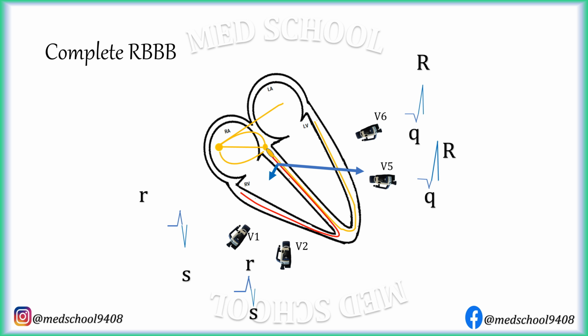Then impulse reaches right ventricle through myocardial cells. This vector is directed toward right. That's why right oriented leads show R prime wave and lateral lead shows S wave. As this activation does not occur through normal conduction system, conduction is slow and erratic. Because of this slow and erratic conduction, R prime wave in right oriented leads and S wave in left oriented leads are wide with slurring and can be notched.